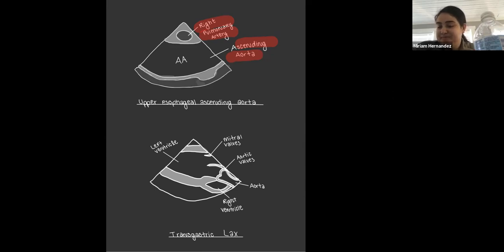Where's my angle on that? I got lazy with the shading on these two. Okay. Do you want to add anything, or should I move on? Yeah, you can move on. I was just trying to find the angle. Where's the angle?